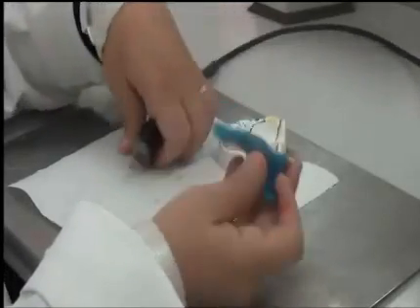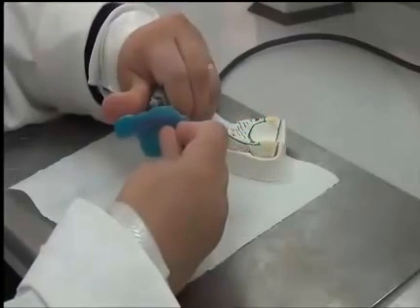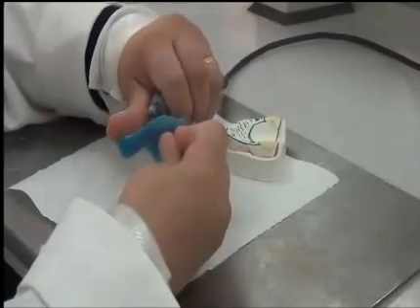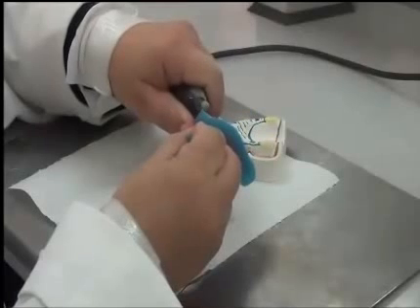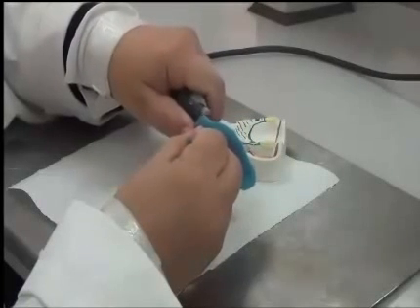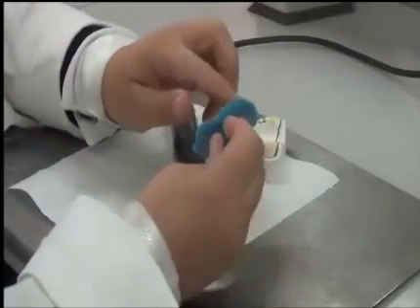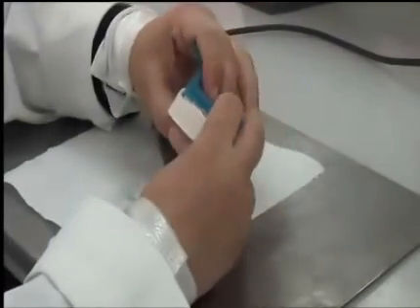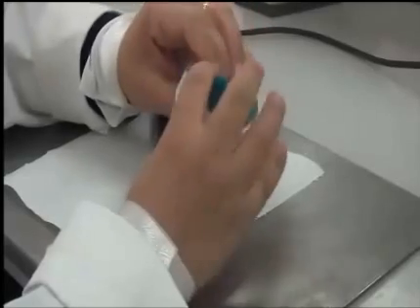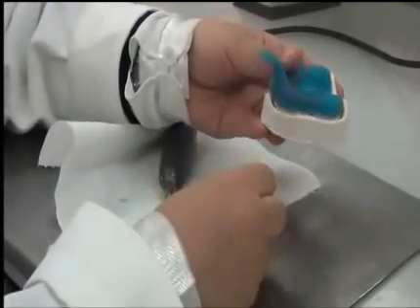Once I'm finished, if I run all around, I should have no sharp edges. There's a sharp edge here that I lifted by my fingers. So I should have no sharp edges. There's a raised bit here. A bit rough, but not sharp. This is where you need your old toothbrush, where you can brush away the particles. And then I adapt it back to my cast and make sure that all of the borders are following the orange line here.